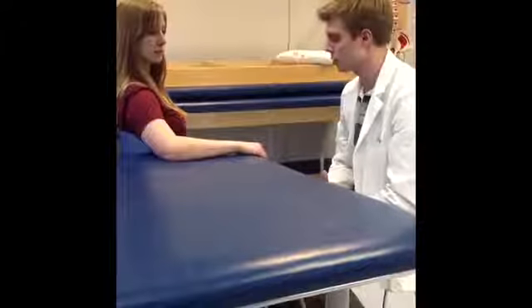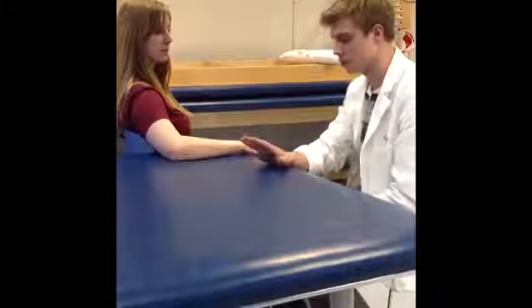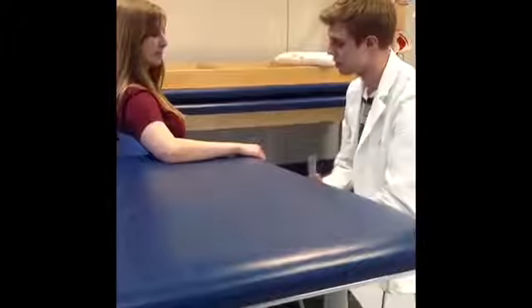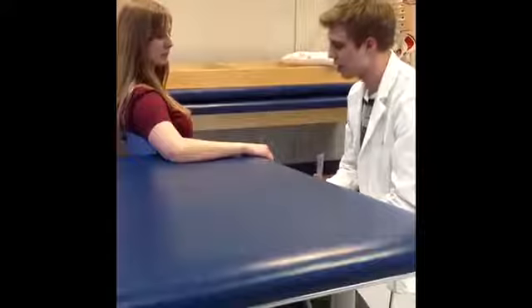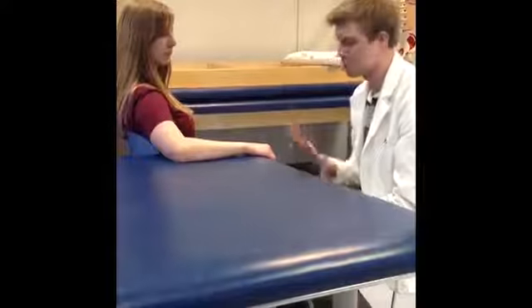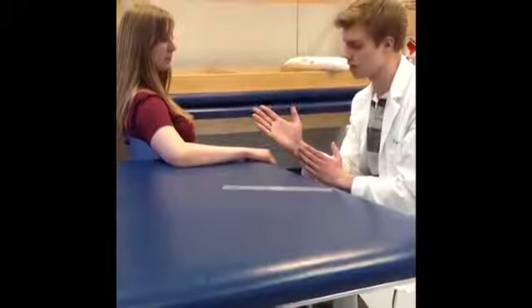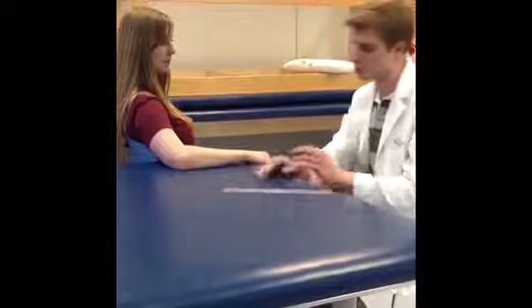And then the only other thing that you can really instruct on is to just let your other joints, such as your fingers, be as relaxed as possible throughout this process. And then the other aspect that you want to explain to them is also what they might feel. You might feel a stretch along the palmar side of the hand. They also might feel a little pressure in the dorsum or back of the hand there.